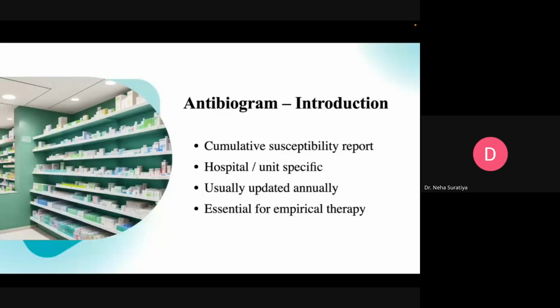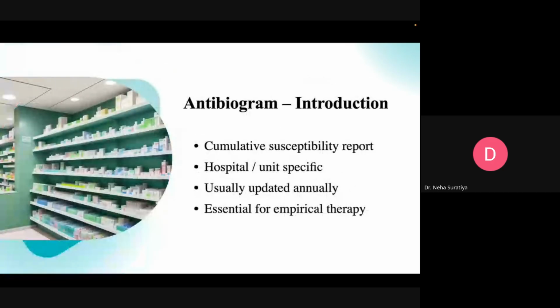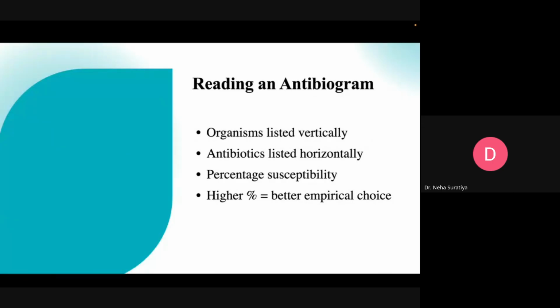If you are working in the hospital right now or going on the ward round, right, ask where is our hospital antibiogram. Try to interpret it. Okay, let me give you an idea how to read antibiogram. I hope now it is clear what actually the antibiogram is, and how to read it. So let us understand how to read it.